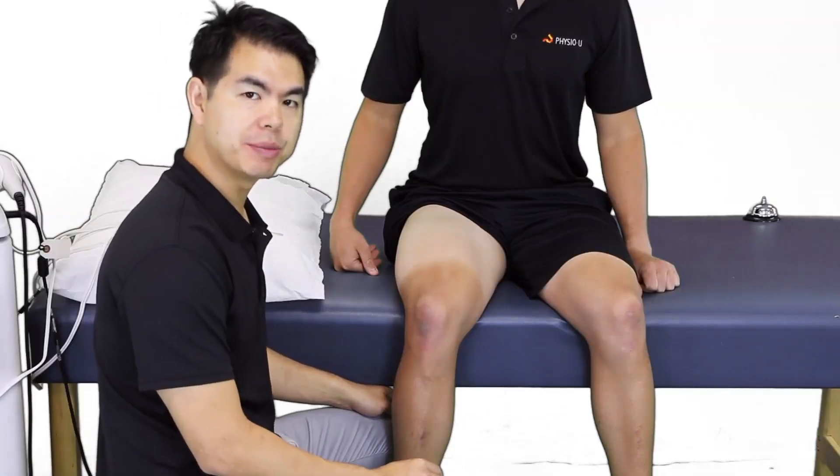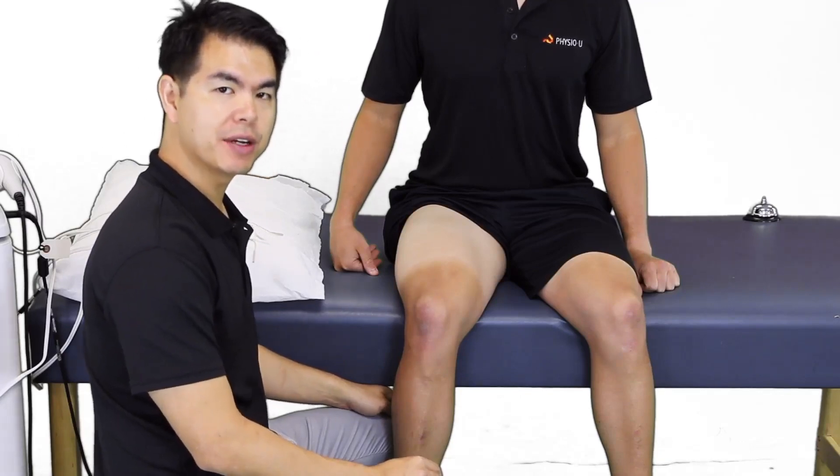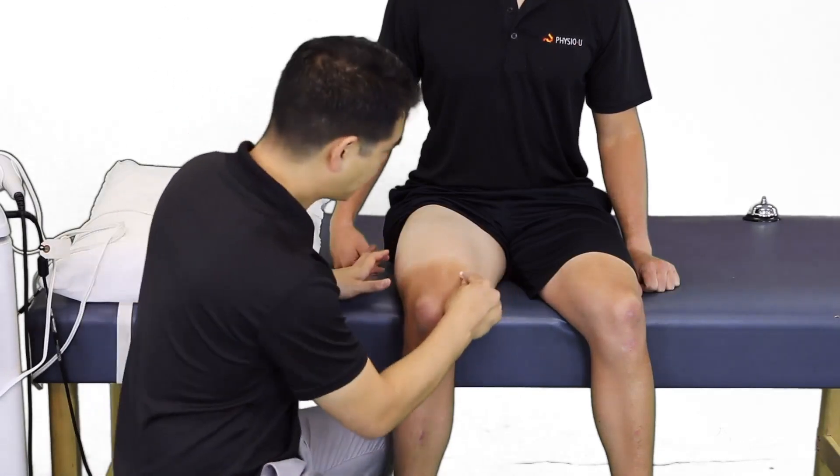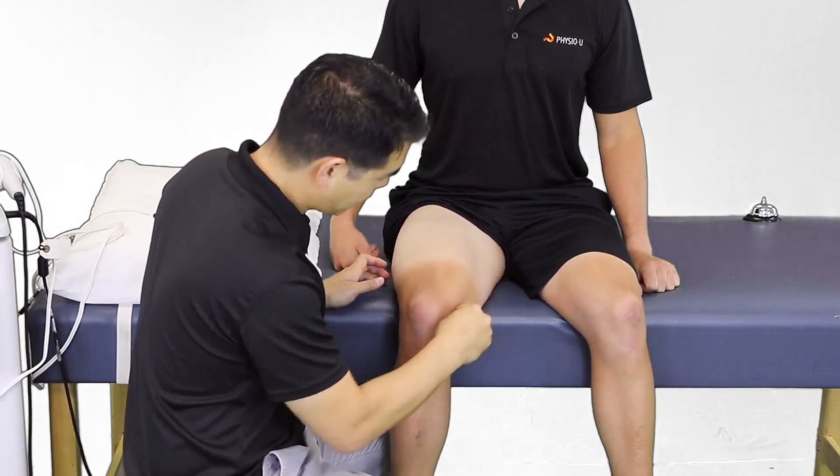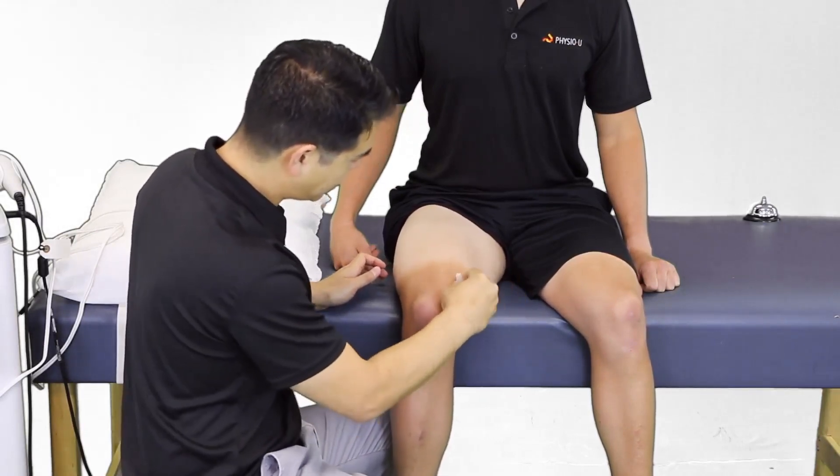In preparation for electrical stimulation, we are going to clean the area for pad application. I'll use a little alcohol swab to clean the oils and dead skin off the region.